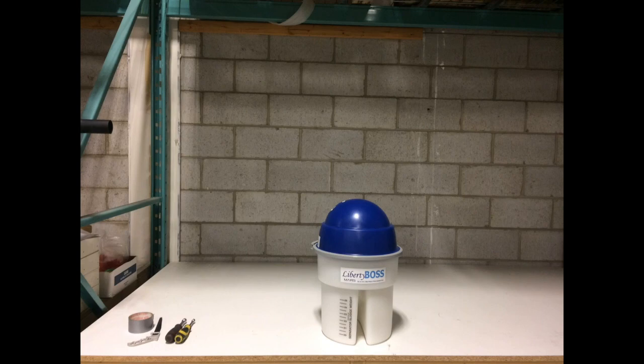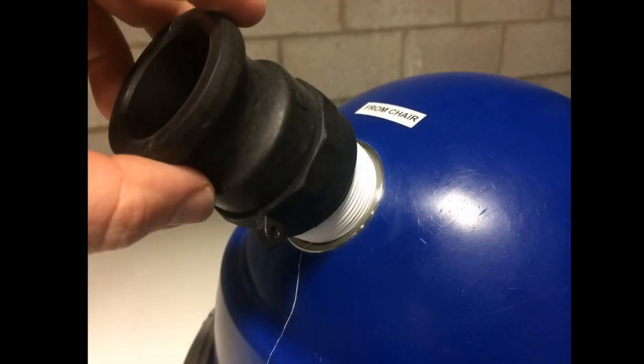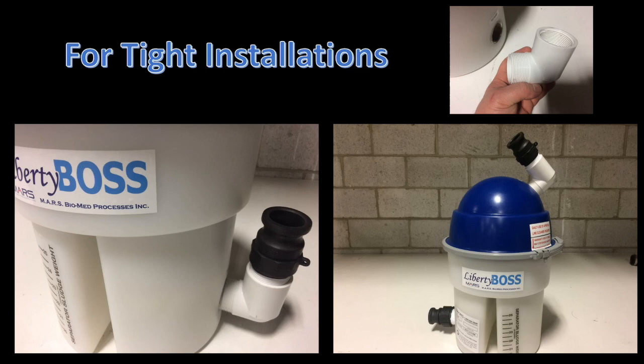Place the Liberty Boss where you think it will best fit in the mechanical room. Thread part A of the Quick Connect into the outlet of the Liberty Boss, then thread part A of the Quick Connect into the inlet of the Liberty Boss. For installations in a small space, a 90-degree elbow may be required — thread the elbow into the inlet or outlet of the Liberty Boss, whichever side does not have room for a straight connection. For the rest of these instructions, we are assuming there is no requirement for a 90-degree elbow.